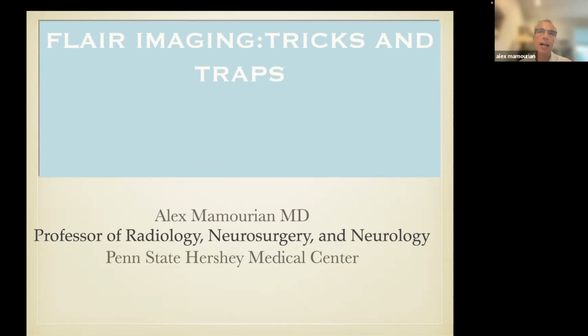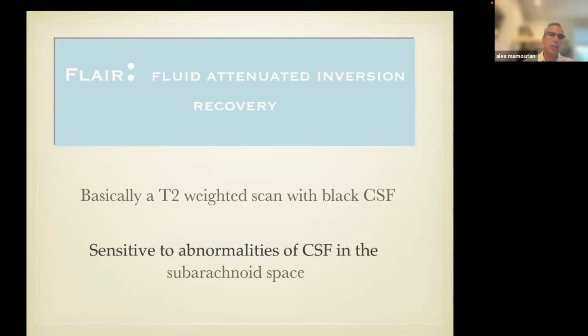I'm not going to dwell on some of the physics today. I'm just going to go quickly through some of this material, and we'll get to the cases. I'm going to try to do this in a poll form. So what I'll ask each of you is, you'll have a polling button, I think, that should appear on your Zoom, and you can vote for which choice you think is optimal. We'll come to that in the next section.